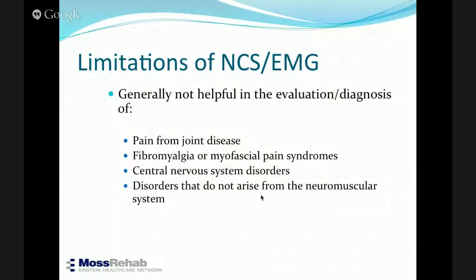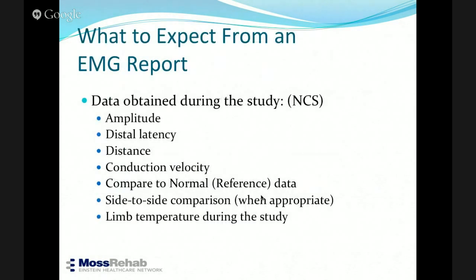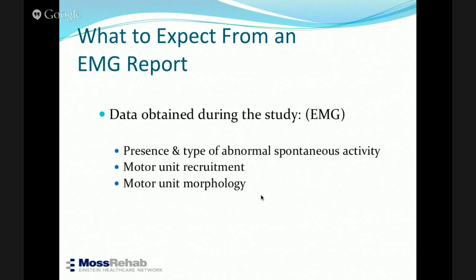Limitations: EMG is generally not helpful in the evaluation or diagnosis of pain from joint disease, fibromyalgia or myofascial pain, central nervous system disorders, and disorders that do not arise from the neuromuscular system. So, you know, the clinical exam should tell you these things a lot of the time. So we already talked about the data from nerve conduction, and the data from the EMG.